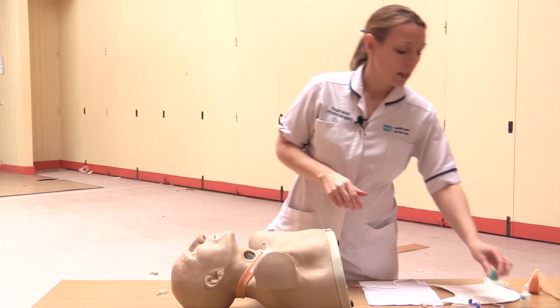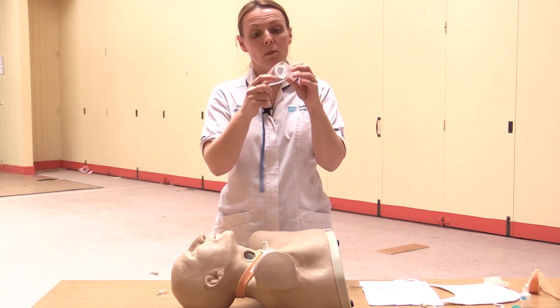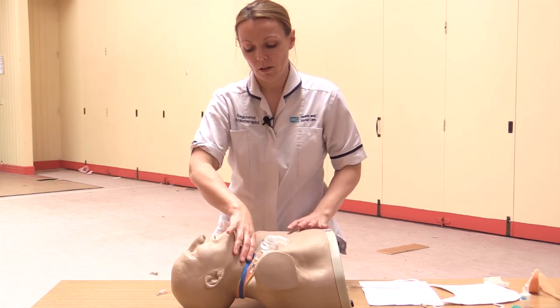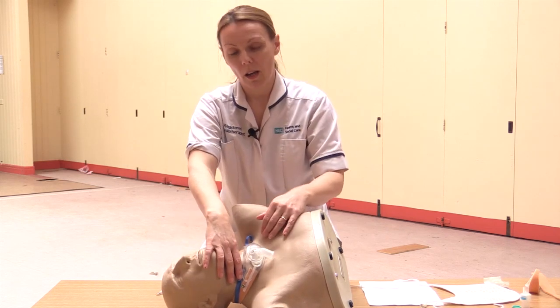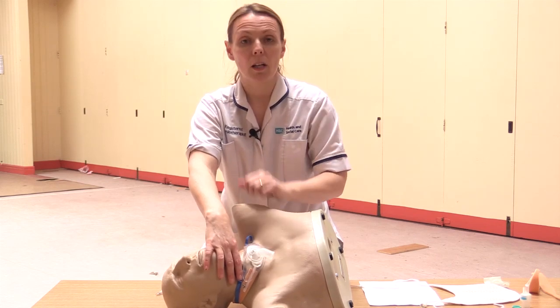Okay. And lastly, if the patient needs oxygen, it must be via a tracheostomy mask, and the mask is just secured around their neck and it's over the tracheostomy site. You shouldn't have a mask over their mouth and nose if they have a tracheostomy tube or if they're a laryngectomy, because they are essentially a neck breather.